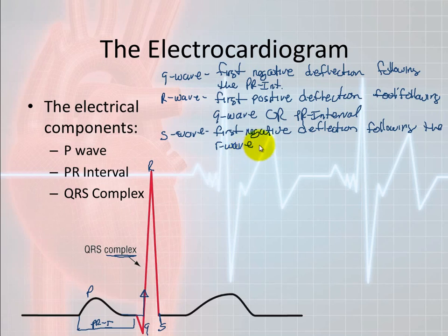In this case, this S wave must extend below baseline. So an S wave must go below baseline.